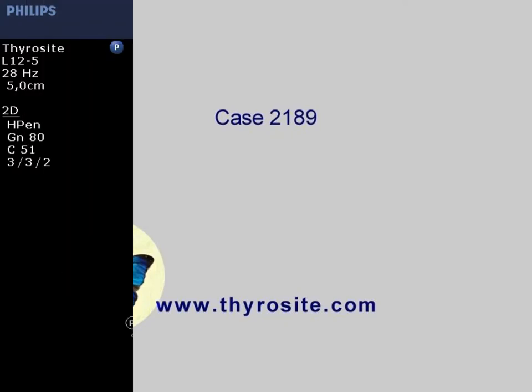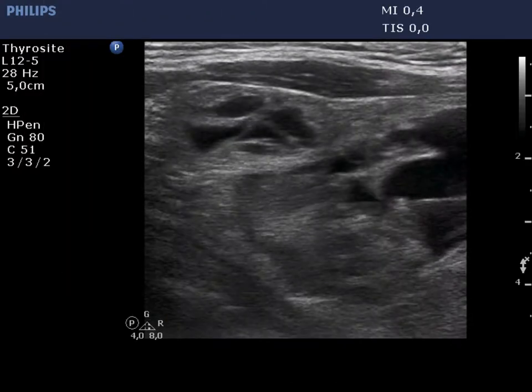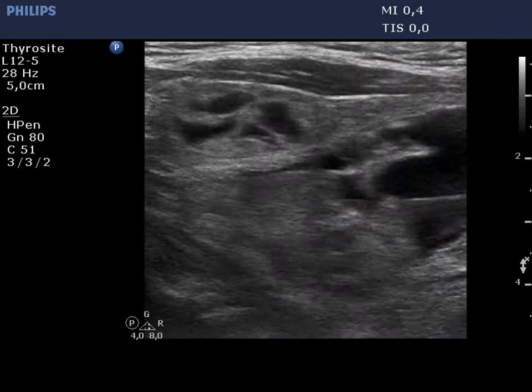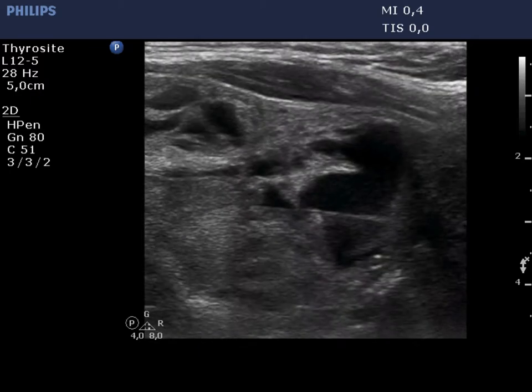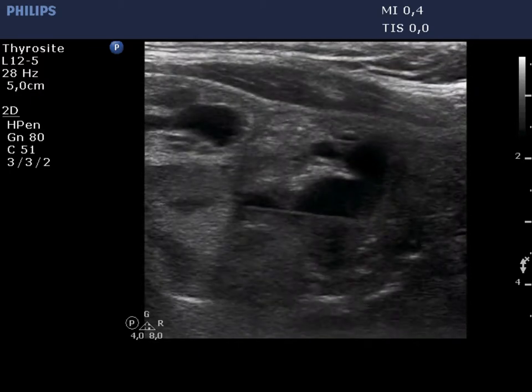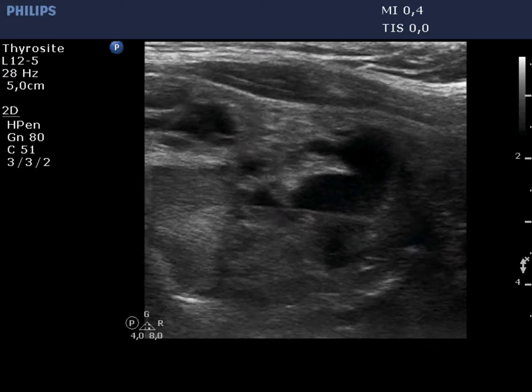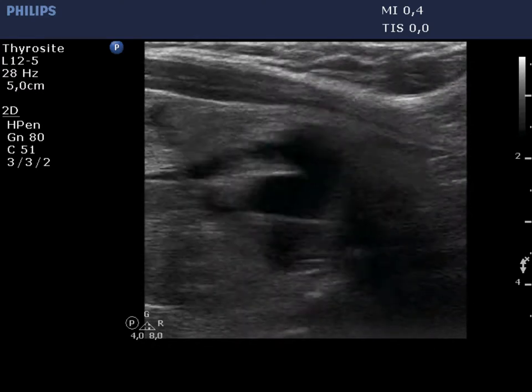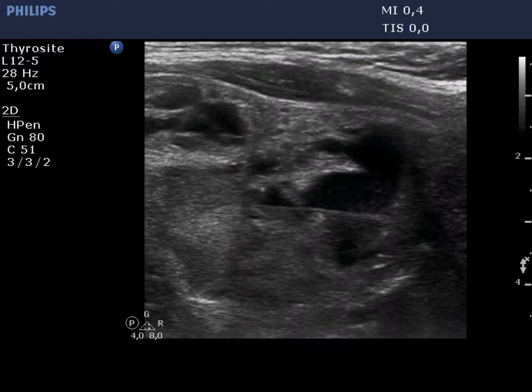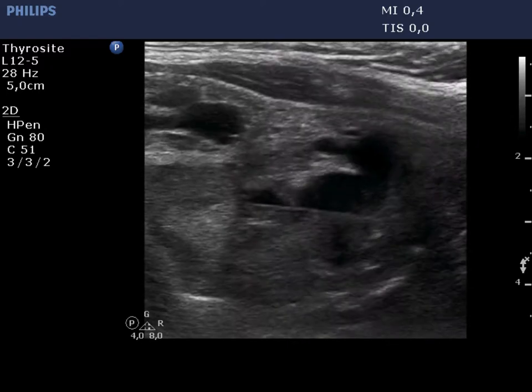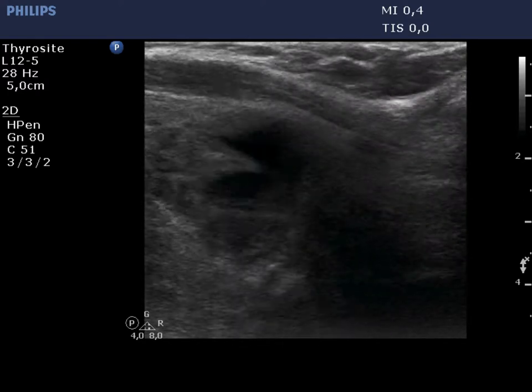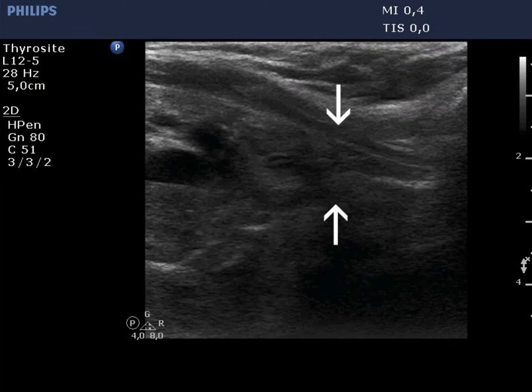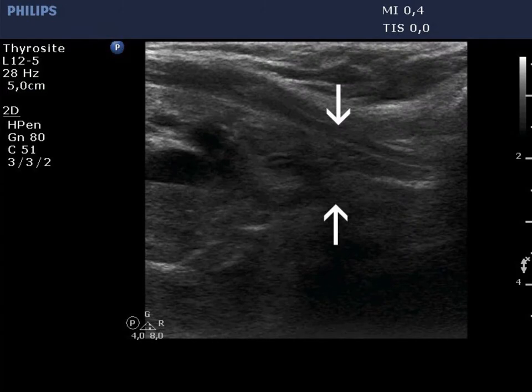The video shows how we can judge the spread to the chest. The longitudinal section of a large multinodular goiter is demonstrated — the right side of the video shows the lower part of the thyroid. Examined with the neck held back in a supine position, the lower pole of the lobe is not visible. The critical point is whether the lower pole becomes visible when swallowing. In this case it did — during swallowing, the lower pole is marked with white arrows — meaning that significant substernal spread is unlikely.